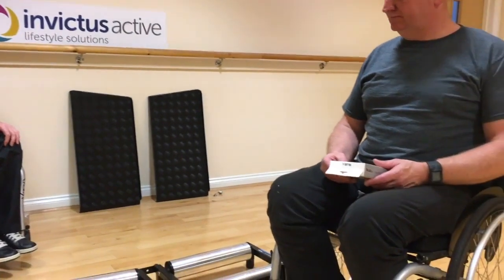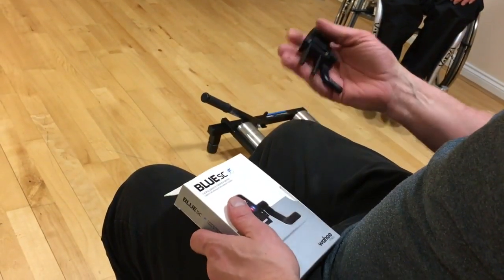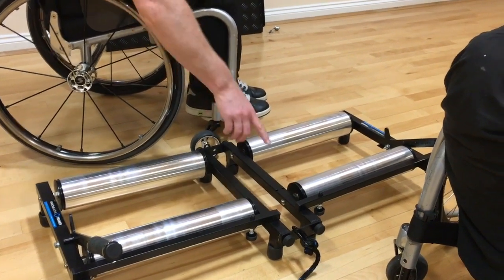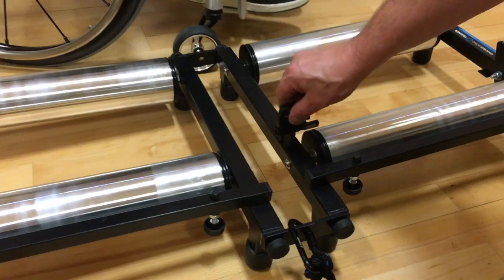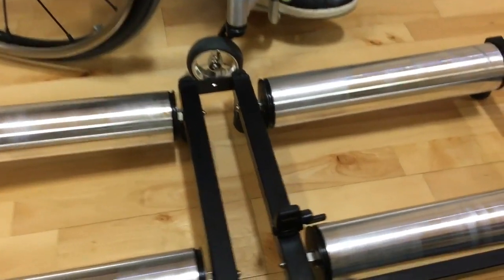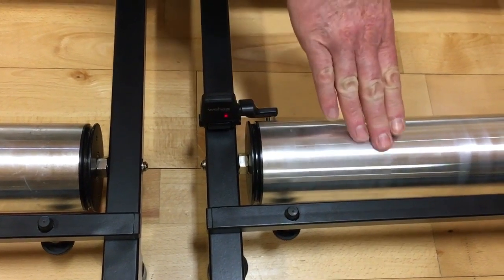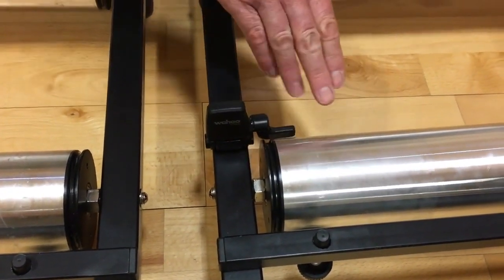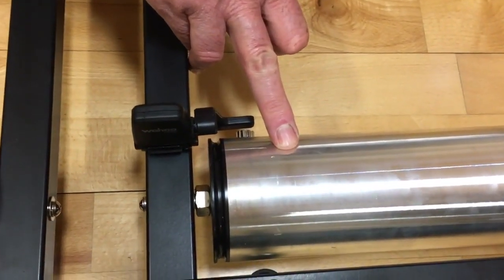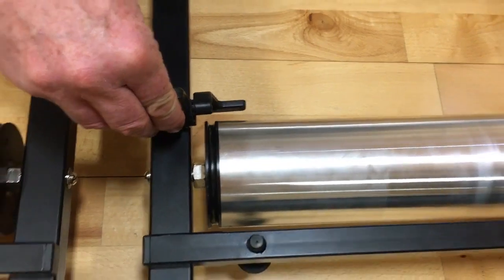If you purchased a Smart model, it'll include the speed sensor. Remove this from the box, then locate it on the trainer — it simply drops into two holes. Having located the sensor, rotate the bar and you'll see a magnet. Position that magnet so the sensor is between three and six millimetres away from it. To adjust the sensor, just rock it back and forwards.